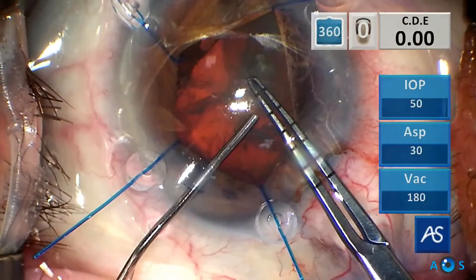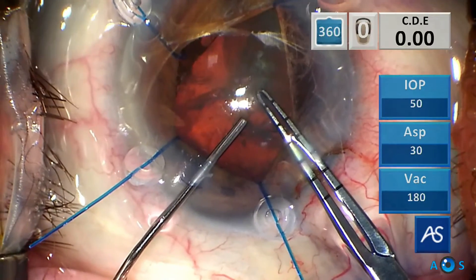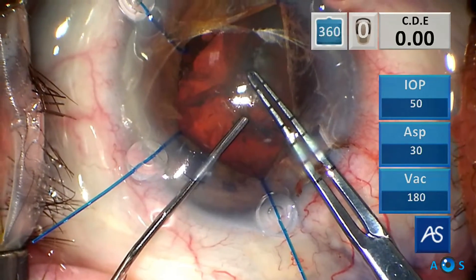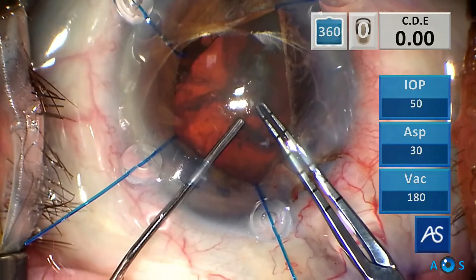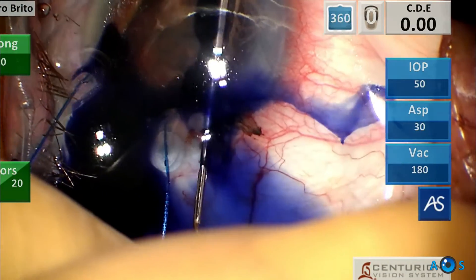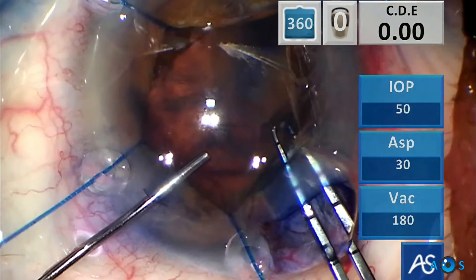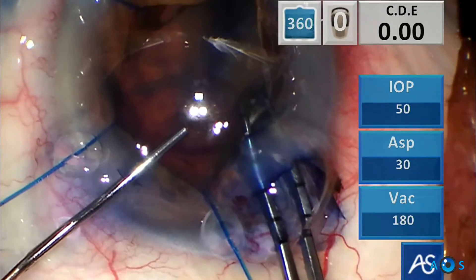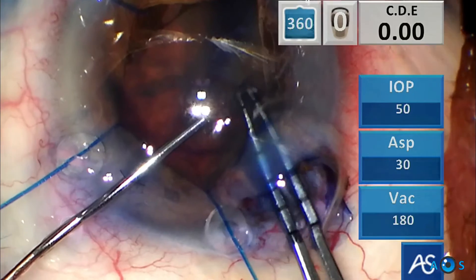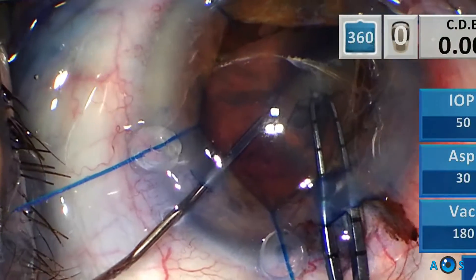As we approach the inferonasal quadrant, the rhexis flap is very difficult to observe even with Trypan Blue. A tearing motion is employed, pulling towards the center to contain the possibility of run-out. However the flap margin is difficult to ascertain, so Trypan Blue is again injected to paint that area of the capsule. Visualization improved and it is clear the rhexis flap is already running underneath the iris, so more OVD is necessary to flatten the flap and pulling it towards the center.